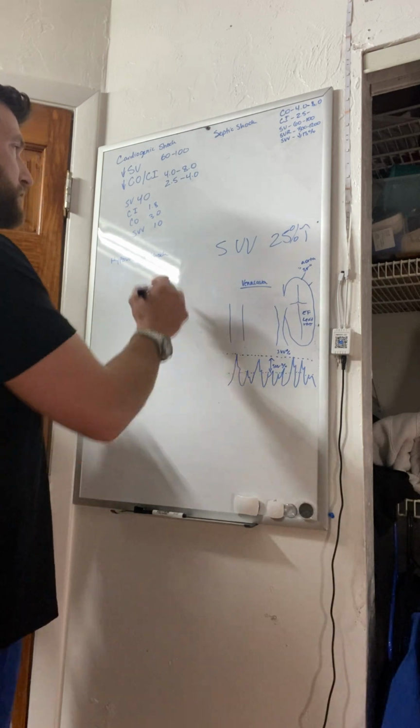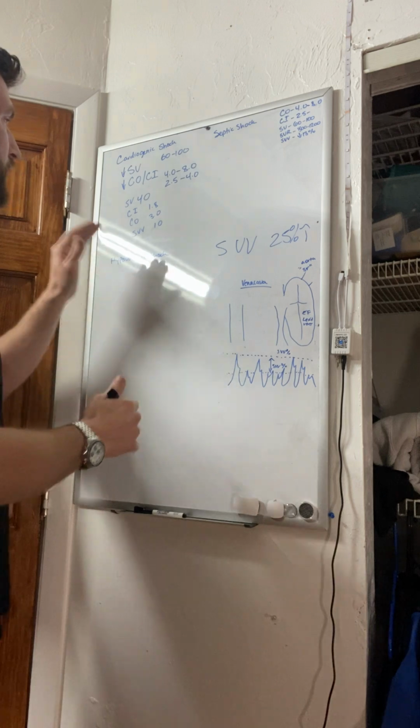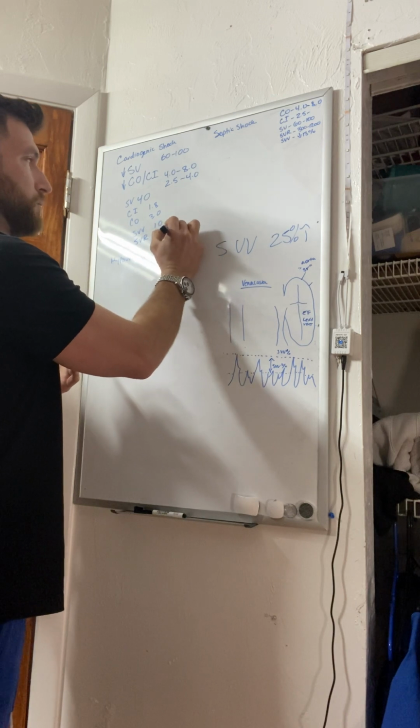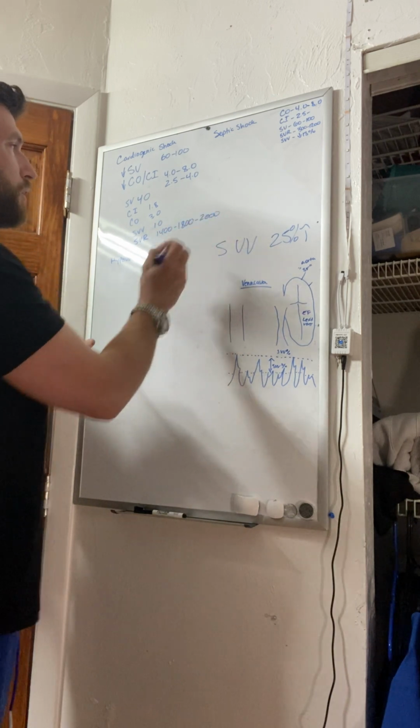Systemic vascular resistance. A lot of times what you'll see on the monitor, at least, is the SVR will be elevated. It'll be 1400, 1800, 2000, right?